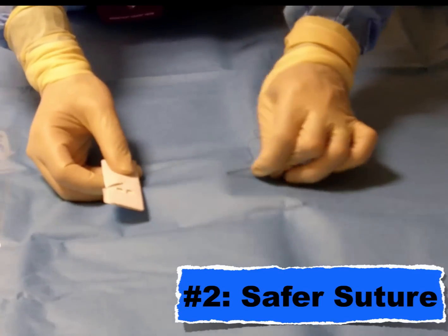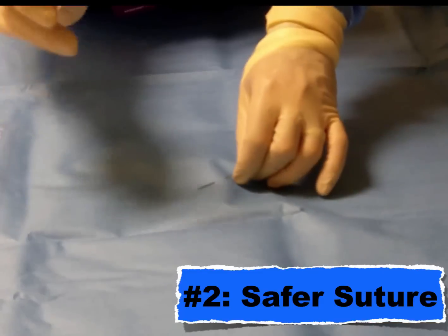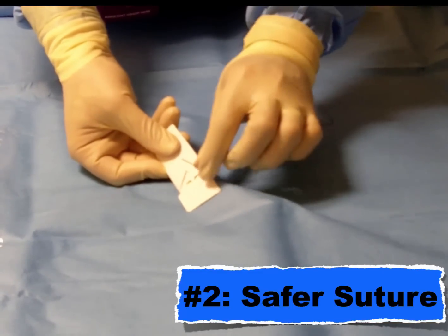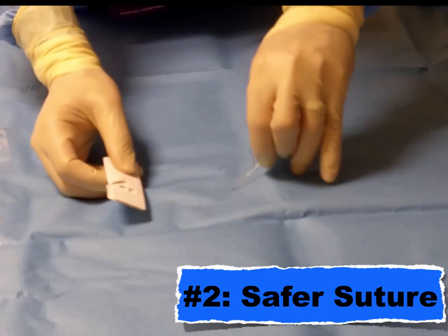Here's how it looks: we're diving into the skin — don't grab that needle tip. Instead, drive it through and use that paper or plastic to direct it out so you can easily grab the middle of the needle. A much safer way to suture.